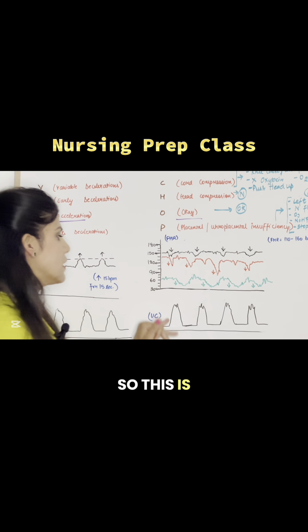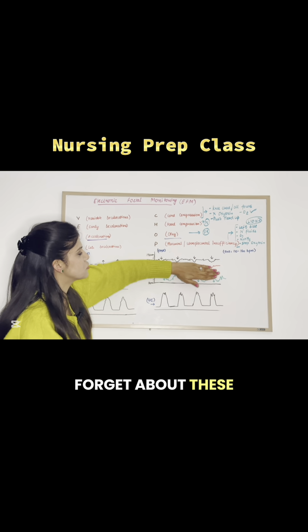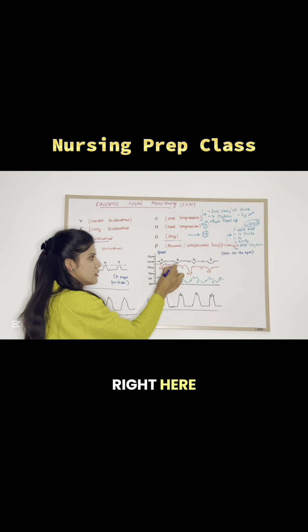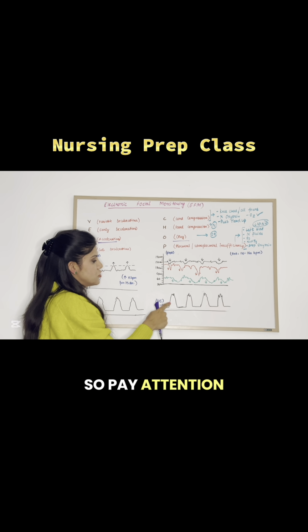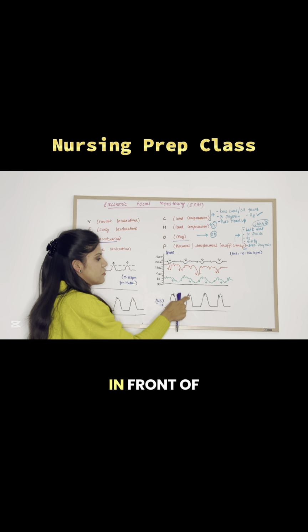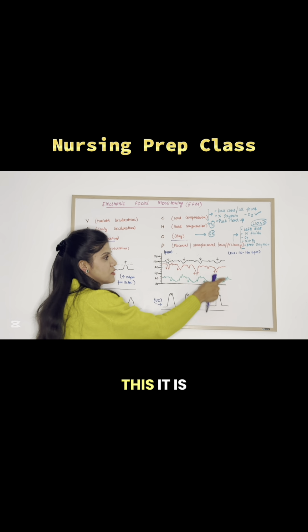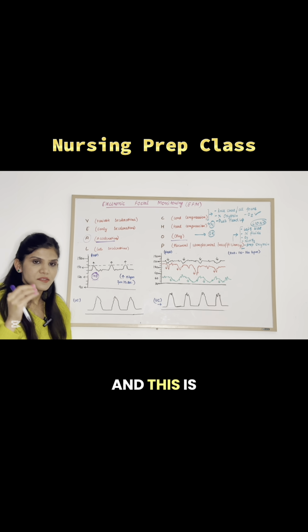So this is a mirror image. If you just forget about these two things and just focus on this and this, you will see that the heart rate data depicted right here is a mirror image of the uterine contraction. So pay attention. In front of it, it is dipping. In front of it, it is dipping. In front of it, it is dipping again. In front of this, it is again dipping. So this is a mirror image, and this is exactly how you will be able to figure it out.